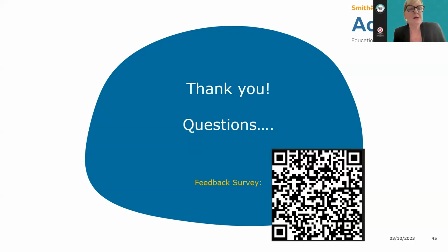Okay, thank you. What frequency of dressing change is recommended in the clinical guidelines for this device? I always change mine about every 3 days. Maybe someone can tell me if that's different, but for negative pressure, I do every 3 days. Occasionally, if it's in a really difficult spot, you may have to do it every two, and for some people I will do it every four, or change it twice a week, depending on their needs. But the regular guideline is every 3 days, but use your judgment call.